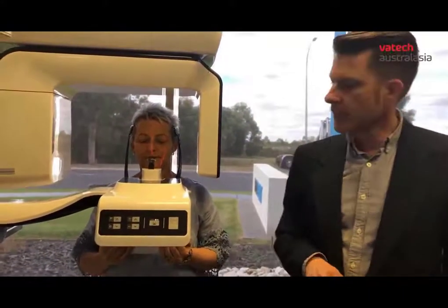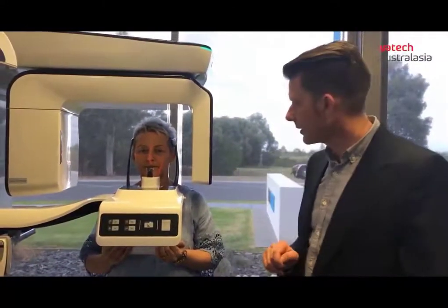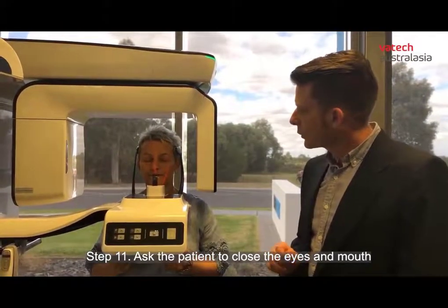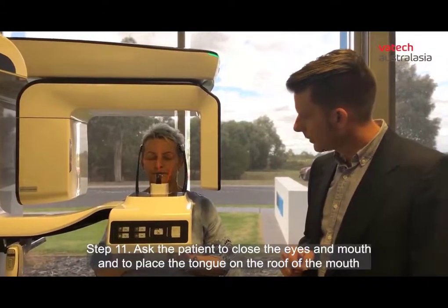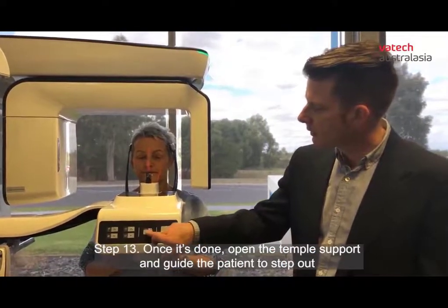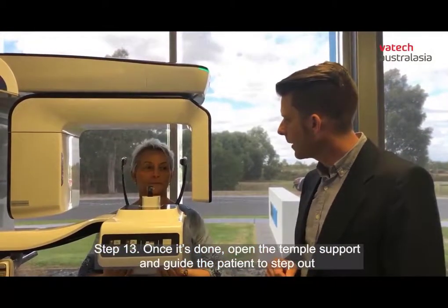Once I'm ready to capture the image, I'm going to click on my check mark here, or ready on the device. It's going to tell the patient to please close your eyes. I would also ask you to close your lips around the bite stick. Go ahead and swallow and keep the tongue flat to the roof of your mouth. And then we would take our image. Once it's done, it's going to open, and you can take a step back to get out.